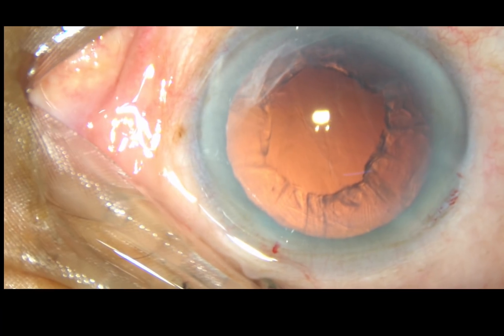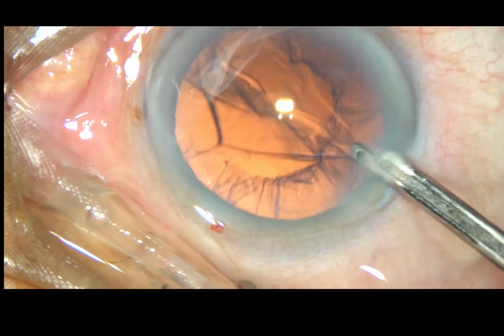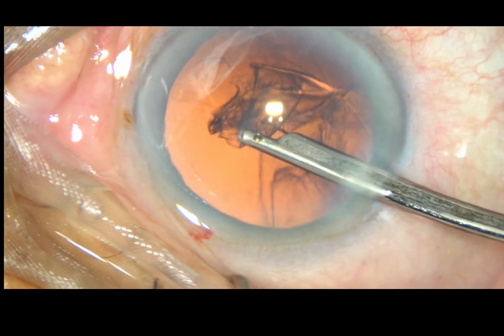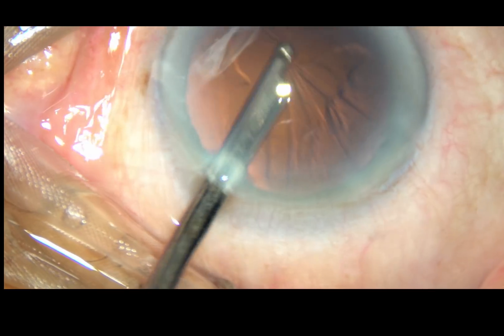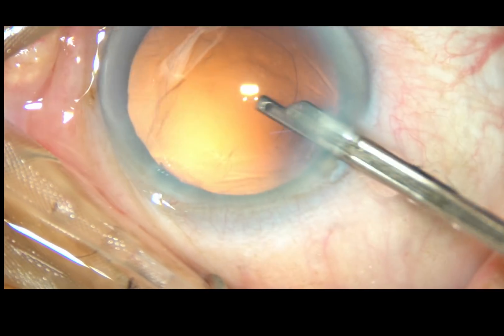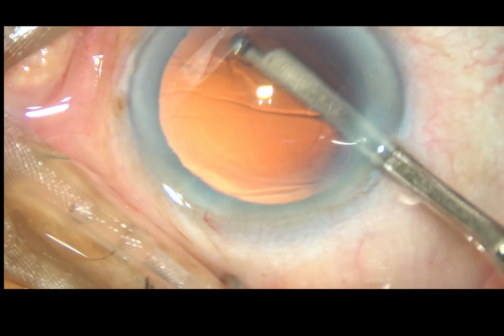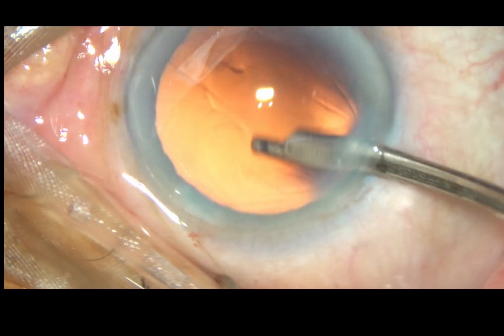Now you can see the rhexis — it is quite small, about 4 mm in size. This is a 23G Simcoe cannula being used for removal of the cortical fibers. See how easily we can remove the cortical matter with this very simple and nice instrument. Sub-incisional cortex is removed. Now some polishing of the posterior capsule is done. The safest technique is probably just sweeping the fluid jet over the posterior capsule.